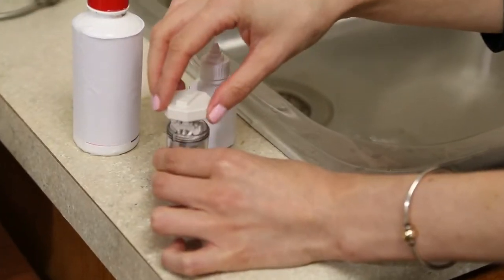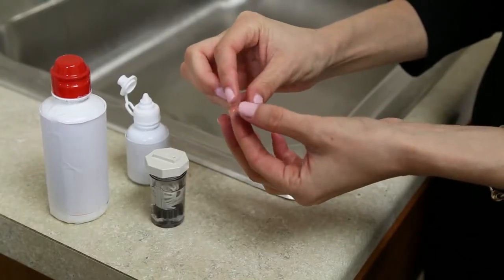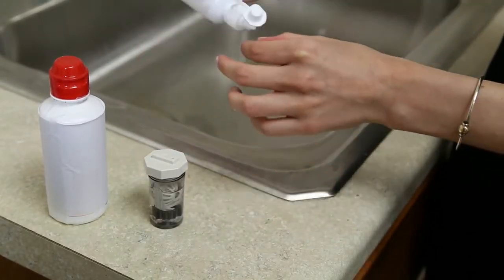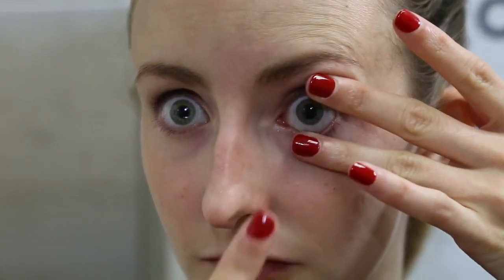For inserting the contact lens, take the lens out of its case. Make sure the lens is cleaned and rinsed. Look down and grab the top lid at the lash line. Look up and grab the bottom lid at the lash line. Look straight ahead and bring the lens to the center colored portion of your eye.